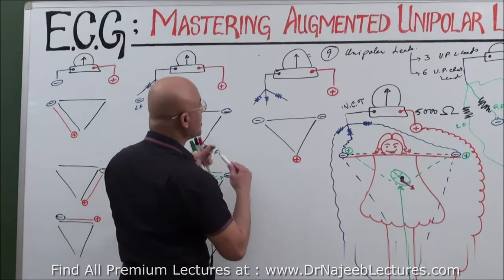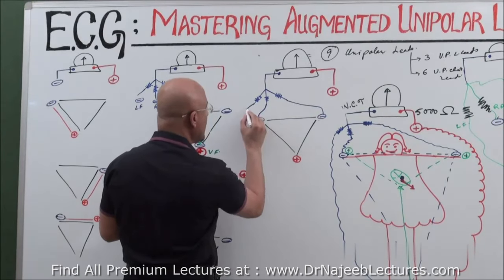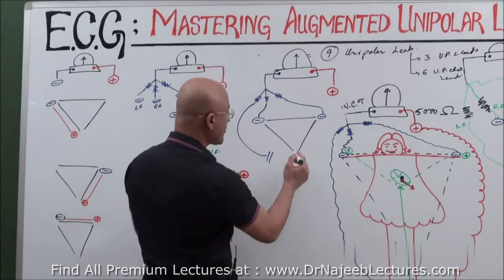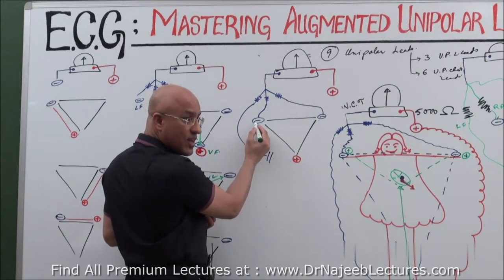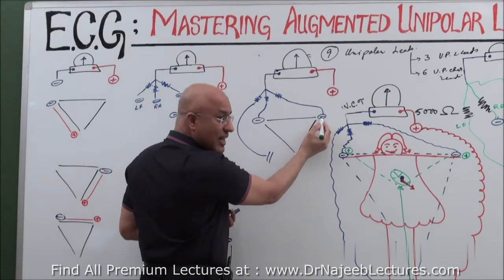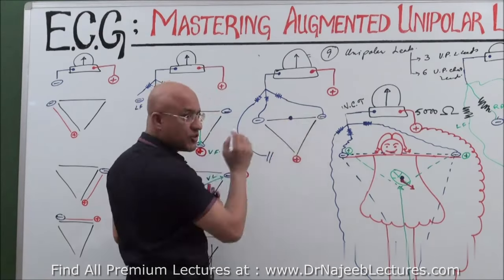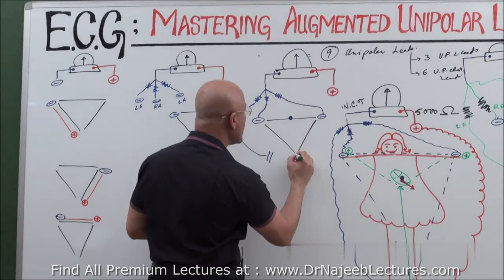So what happened? When he disconnected, let's suppose this is connected here, right? This is connected here, and this one was disconnected when he is recording here. What happened? Now this is looking in between these. Now it is no more looking upward and rightward, no more looking upward and leftward. It is looking straight up. So we can say that virtual electrode has been shifted here in between these two negative. And still we get the same, what is this? Same axis.